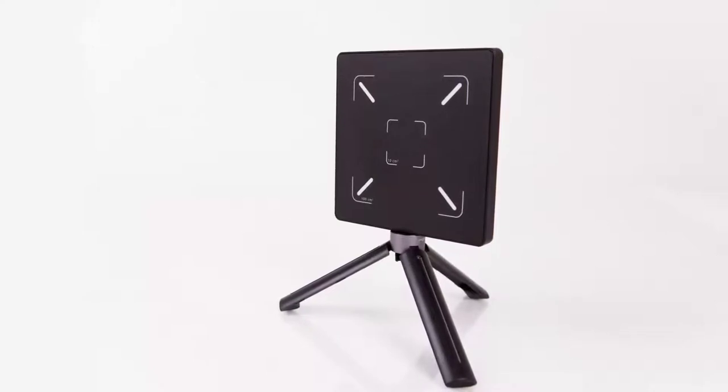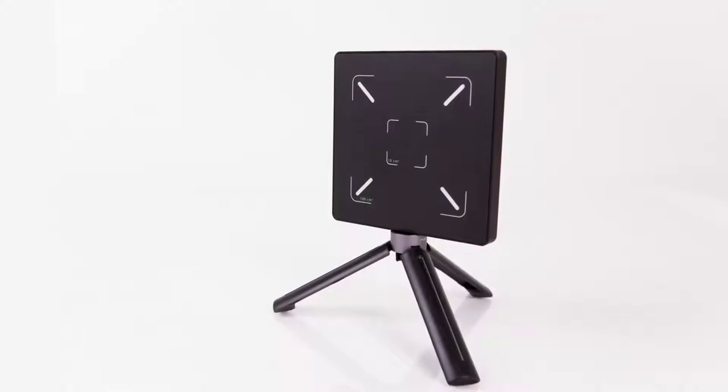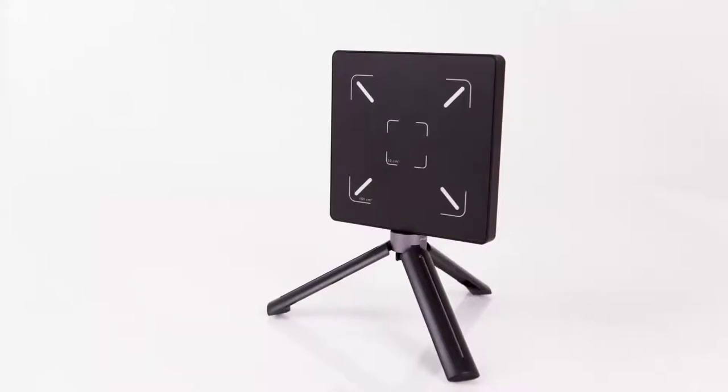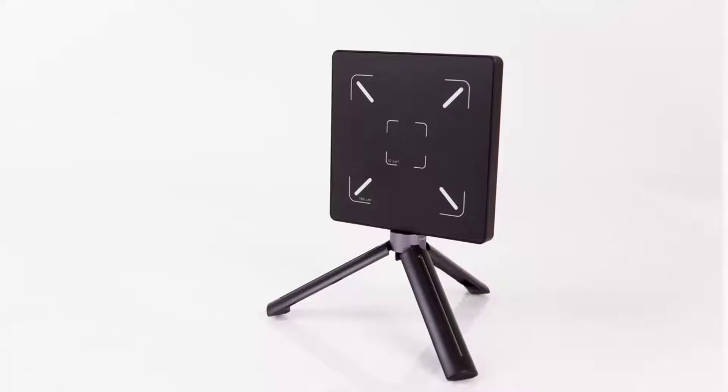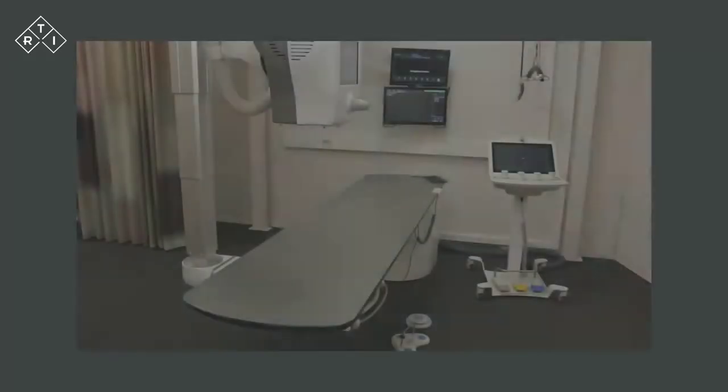The Scatter Probe is designed building on the successful solid-state detector design used in all RTI instruments since the start in 1981. Benefiting from 40 years of experience, the Scatter Probe offers industry-leading sensitivity and responsiveness, making it ideal for detection of the very low levels of radiation typical for scatter and leakage in diagnostic X-ray.